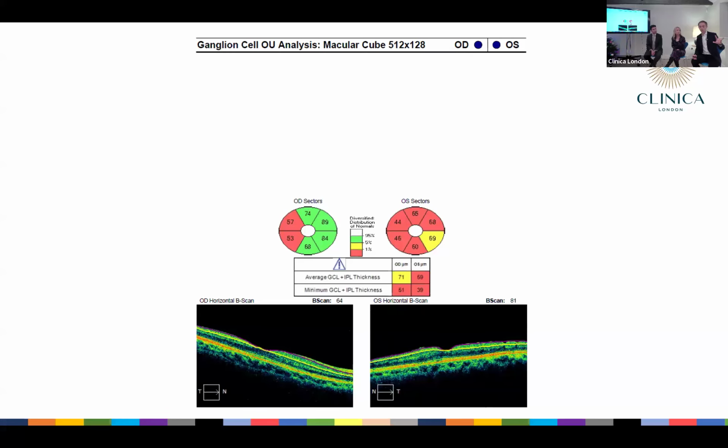if I've got time, I don't want to overspend my time. I've got stuff on showing that, but somebody like that, I'm monitoring his OCT. There's almost no point in monitoring his visual field because you won't see anything. But if you've got a good OCT, and really the best in class is the Heidelberg Spectralis for this because of the registration it does, then you can monitor for change. His pressure now in the eye that was higher is around 22. So you might think, well, is that low enough? Well, actually, so far it has been, and I'm confident he's stable with very nice OCT scans.